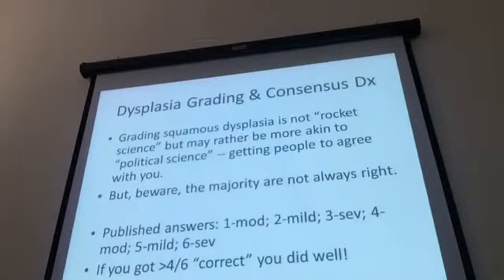But the point of this is that dysplasias are not highly reproducible. We aren't all going to achieve total consensus with what somebody else says. And so grading dysplasias is a challenge for pathologists' consensus.